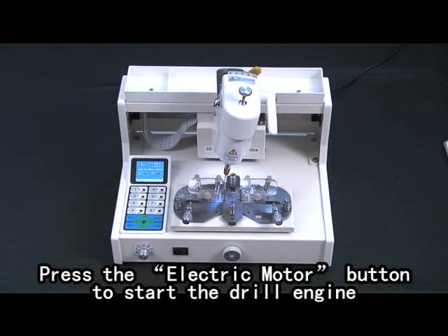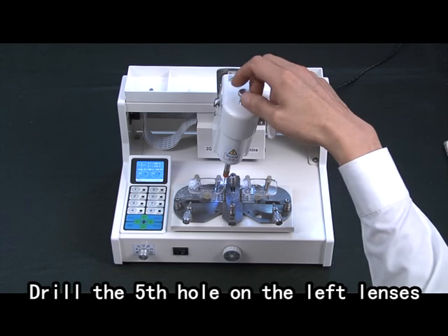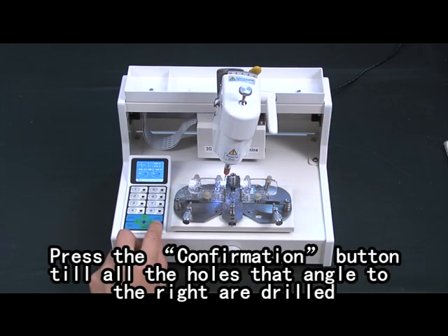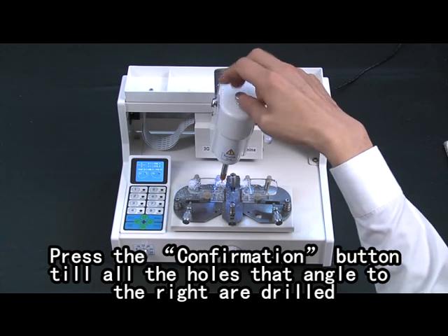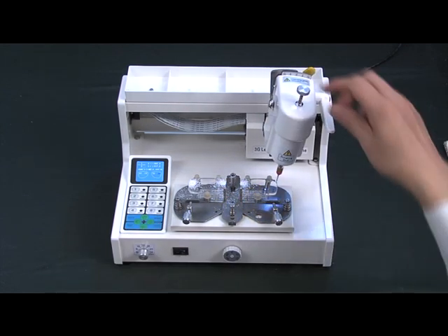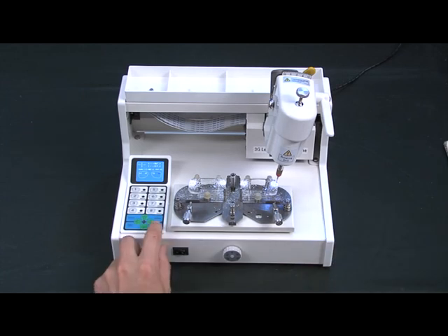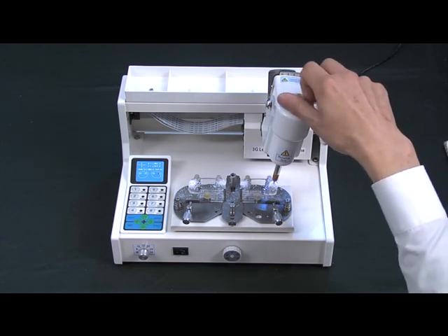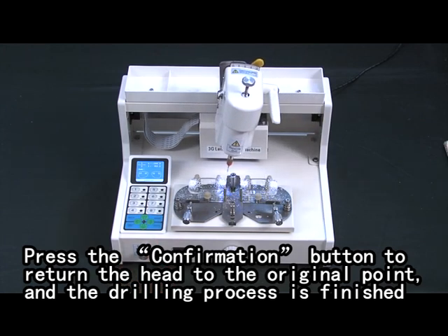Tilt the head to the right. Press the electric motor button to start the drill engine. Drill the fifth hole on the left lens. Press the confirmation button when all the holes angled to the right are drilled. Press the confirmation button to return the head to the original point and the drilling process is finished.